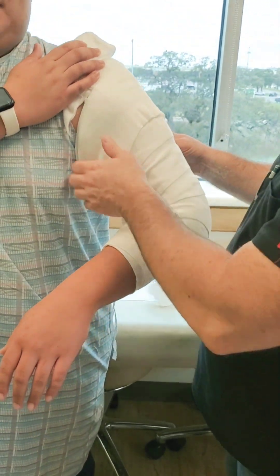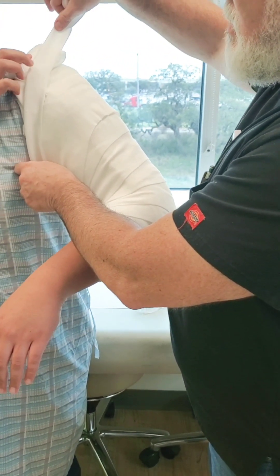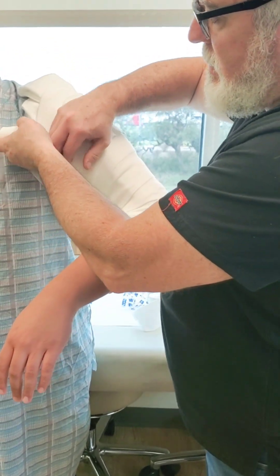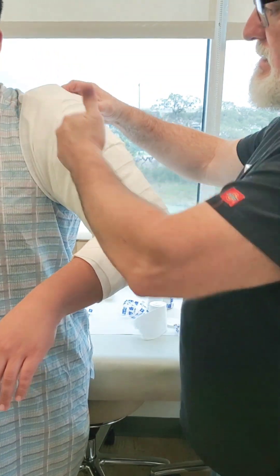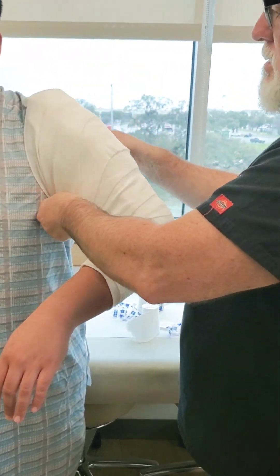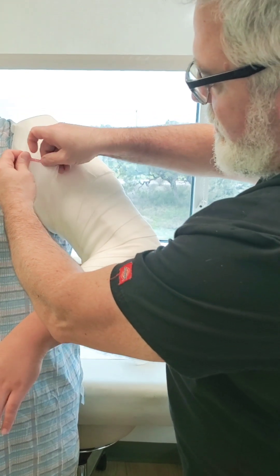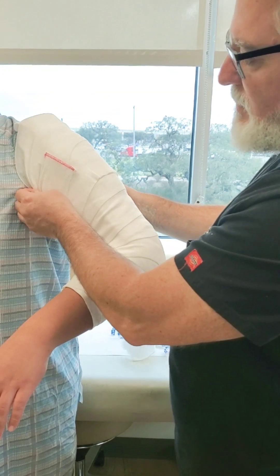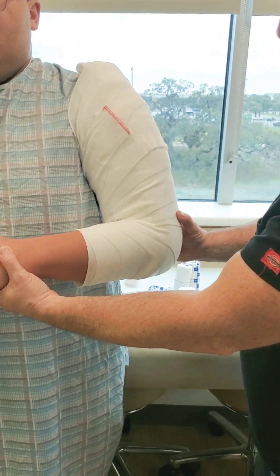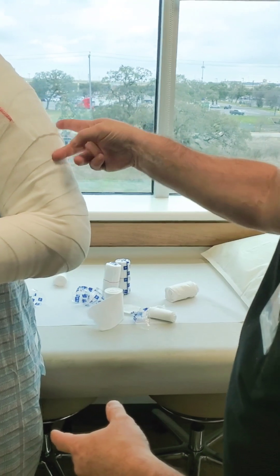I'm going to use a smaller ace wrap to go around the top. Take the ace wrap, fold it in half, let go to create your anchor, come back under the armpit, secure it from the top down with just a little bit of tension — just like so. And that is pretty much your coaptation splint. You can secure it with a strip of tape if it's a pediatric patient and you think they might mess with it.